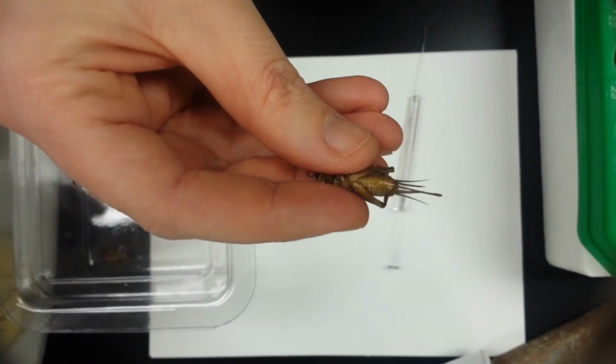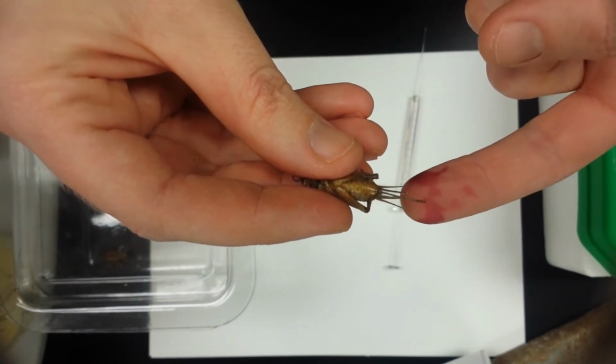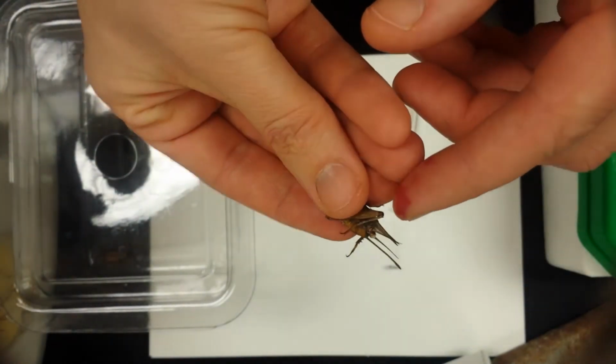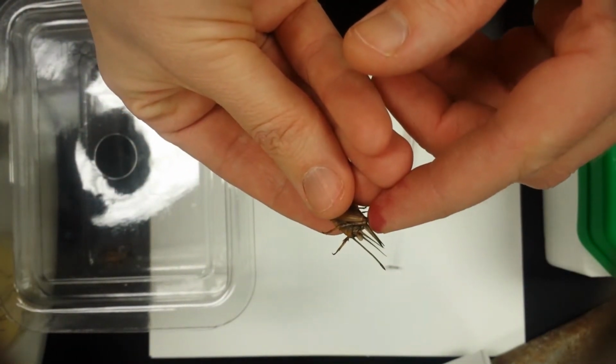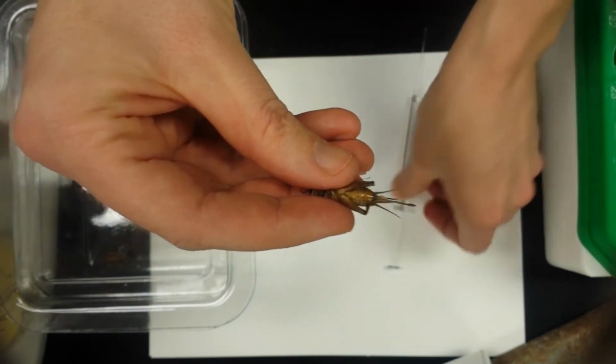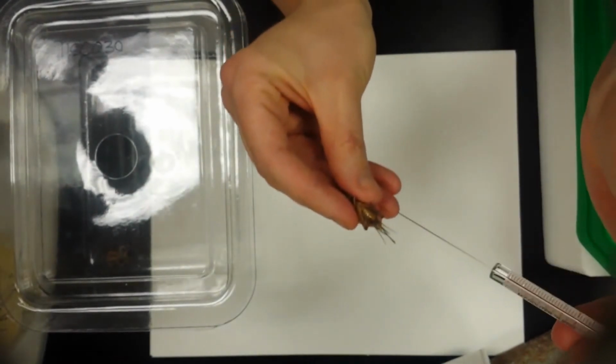Okay, so what I've got here is a long-winged female. So you can see her ovipositor right here, and then her rear flight wings are actually sticking out back here behind her wing covers. So I'm going to go ahead and give her an injection into the abdomen.